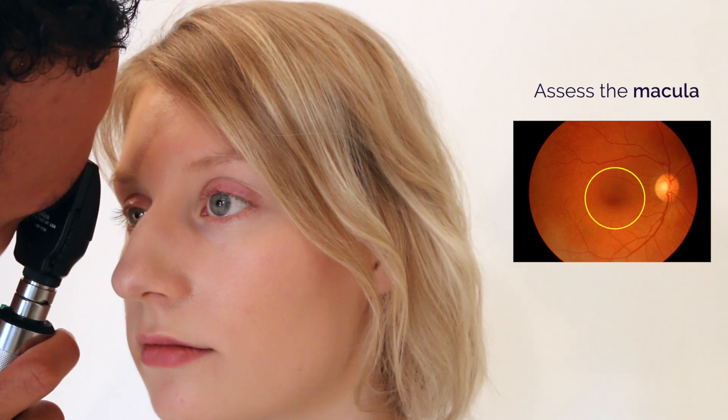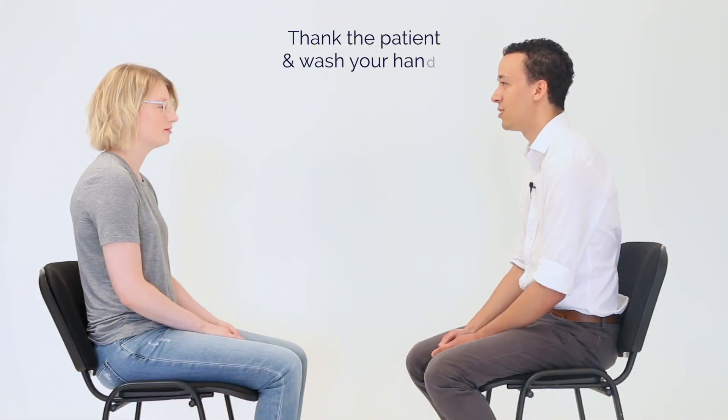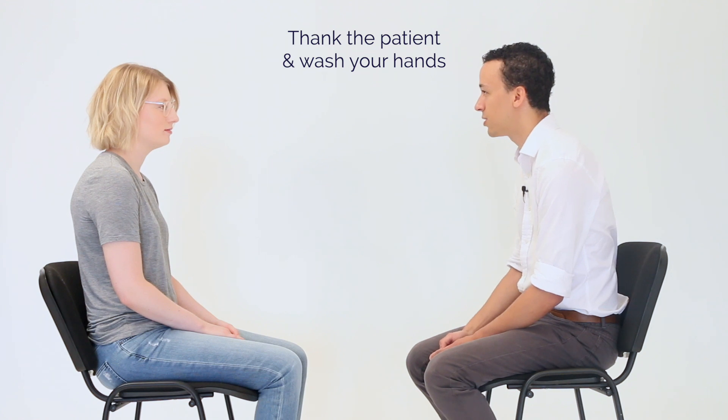I'm just picking up just a little bit of light for me please. Okay, that's the end of the examination. Do you have any questions before we finish? No, okay, thank you very much.